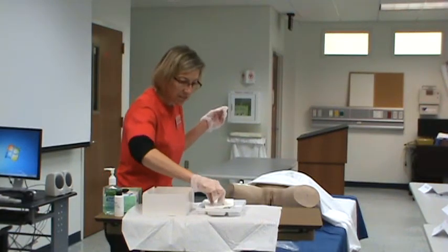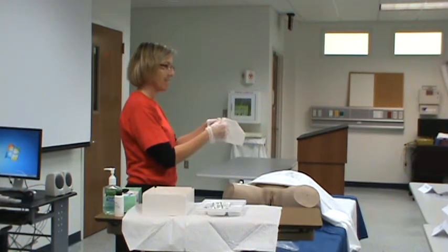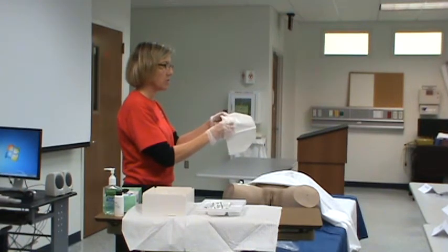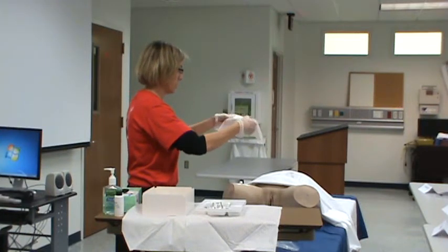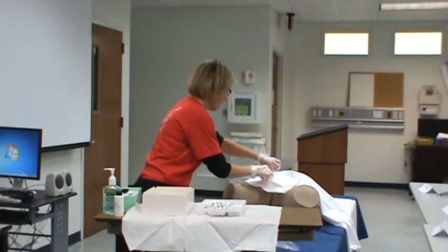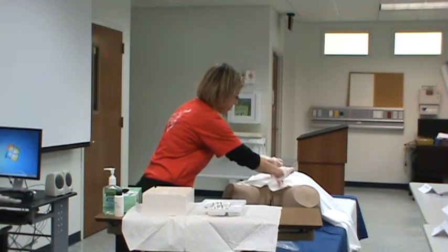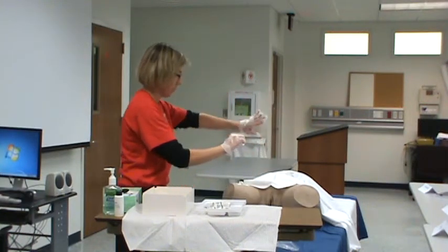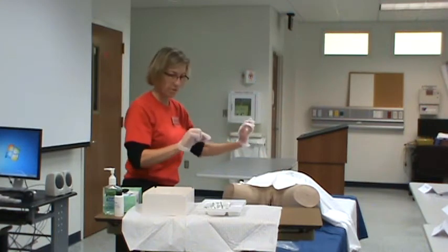The next piece is your fenestrated drape with a female. You guys have choices. You can choose to use it or not. And if you do choose to use it, I just have the students go, oh, no, that's bad. So then I kind of have it right here. It gives you a little extra layer of protection when you touch with your left hand. Personally, I don't use them, but I am today for you.